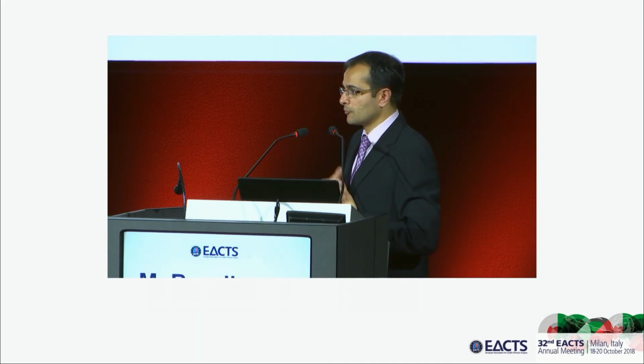So my approach to this, again, is that you can use the same sizing method that you use for a valve-sparing reimplantation approach. You can still measure the left non-commissural height and use that as the size of, for example, the Dacron band that you would use. So it, in fact, has the same effect as a valve-sparing root replacement has, because it's implanted in exactly the same position. The question is, how do you achieve that size? And again, I would argue that if you do the same circumferential annuloplasty sutures as a root reimplantation procedure, and now you restrict by the same size band, that it helps you achieve the desired annuloplasty.